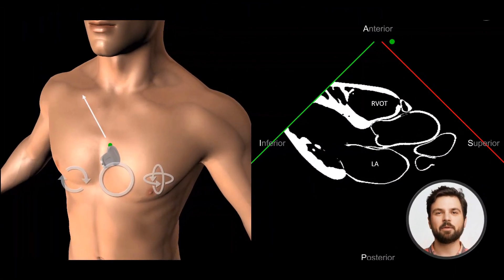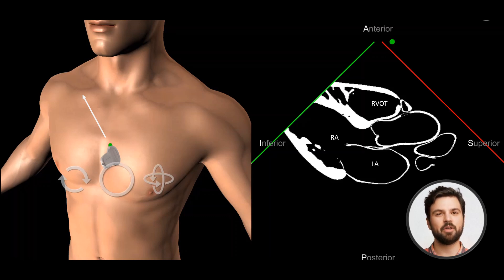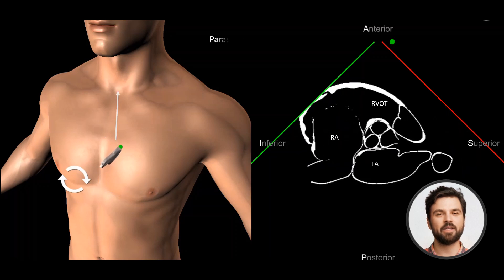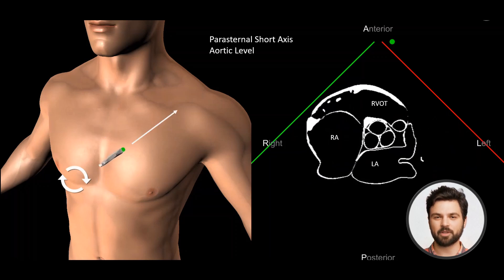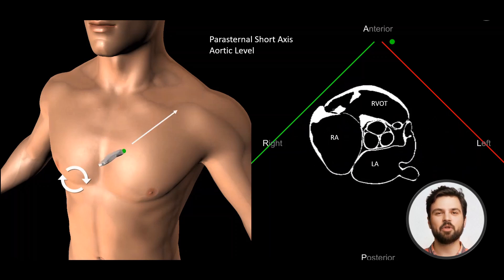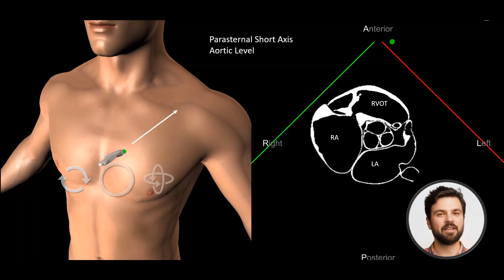The next view is the parasternal short axis view. From the long axis view, we rotate the transducer clockwise by 90 degrees. The transducer orientation marker should now face the patient's left shoulder.